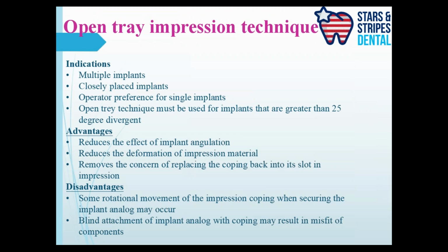Okay. So what are the indications? Now, the open tray impression technique actually is my favorite impression technique. All of my cases, either single or multiple, I don't care. Any implant that I place, I have been doing the open tray impression technique only in my practice. Sometimes in certain cases I do the closed tray impression technique.